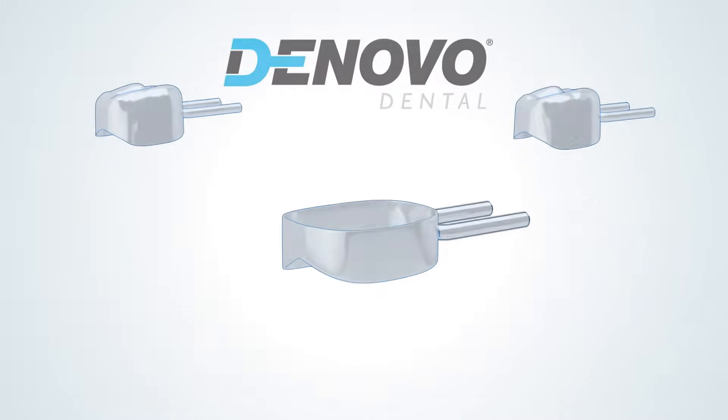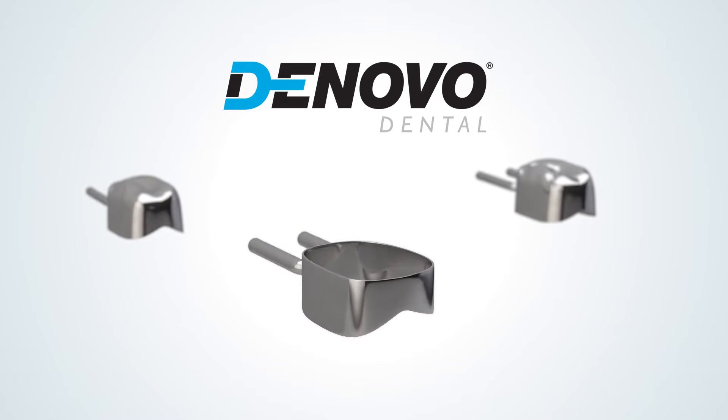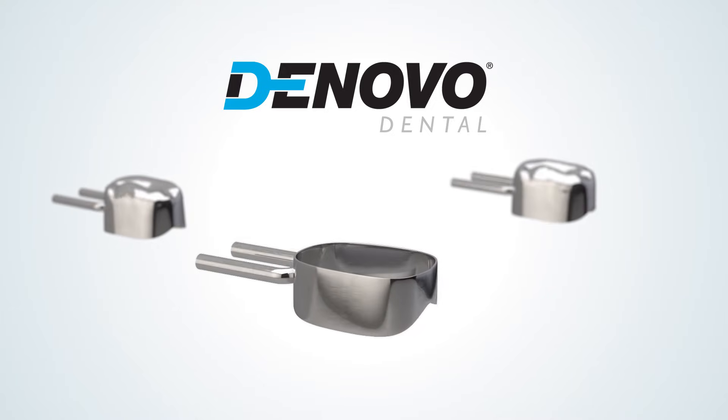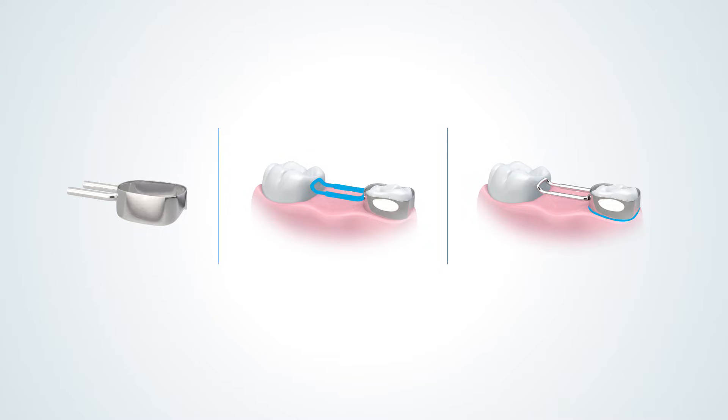The DeNovo Chairside Space Maintainer System streamlines the process of creating and installing a custom unilateral space maintainer. This three-step process only requires one patient visit and can be completed chairside in just minutes, all while the patient is still numb from extraction.